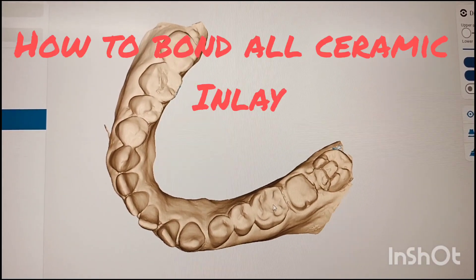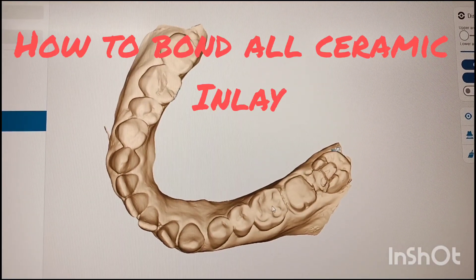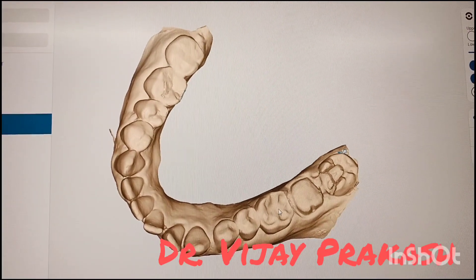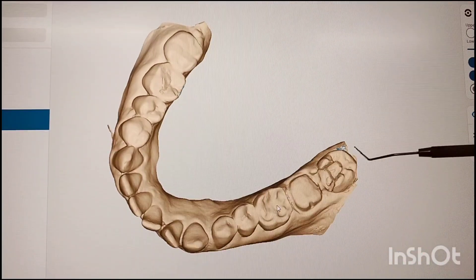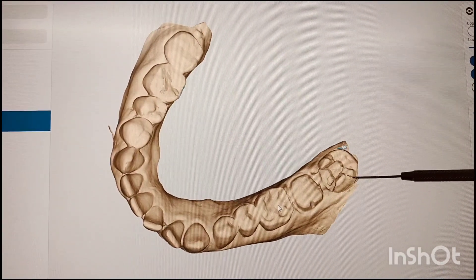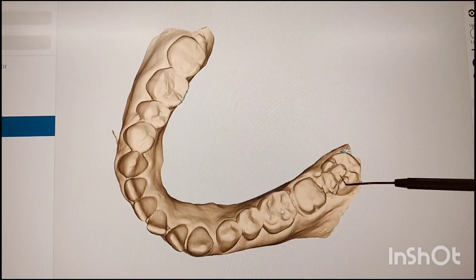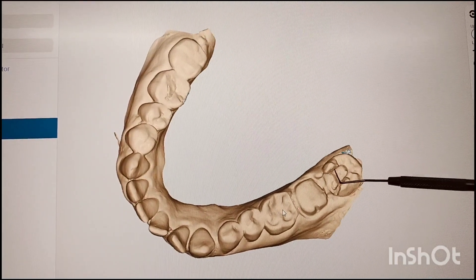Hello friends, I am Dr. Vijay Prakash and today I will be telling you how to bond all ceramic inlay to the prepared cavity which you can see here. This is the prepared cavity and in this we are going to bond all ceramic inlay within the confines of this.